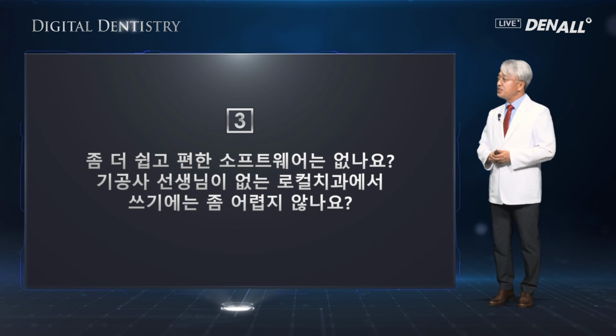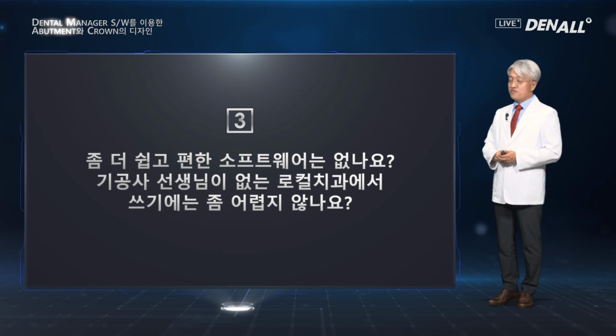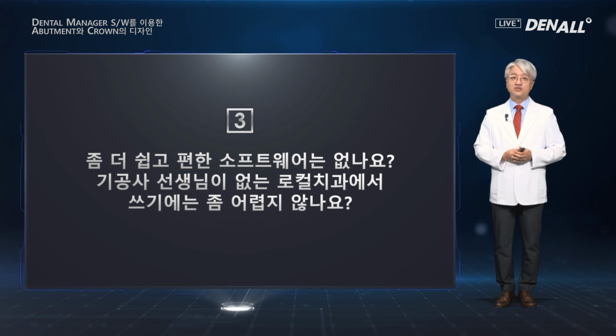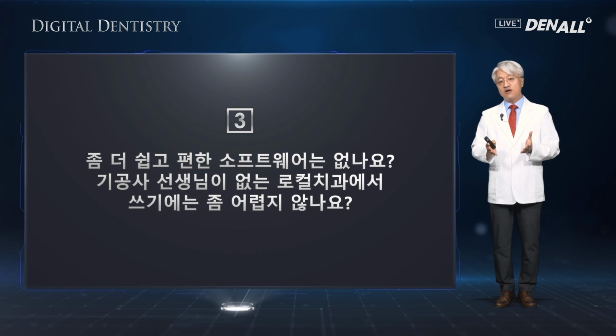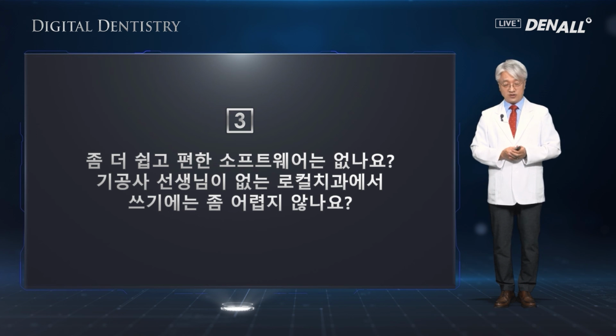Third question, is there a software that is easier to use? If you don't have a lab technician in your clinic, isn't the software difficult to use? Currently, in the clinic system in Korea and in other countries as well, there are not many local clinics with lab technicians. So if you have a lab technician, the work can be done more easily and efficiently. But the software is being updated and upgraded so that clinics without local lab technicians can use it easily.